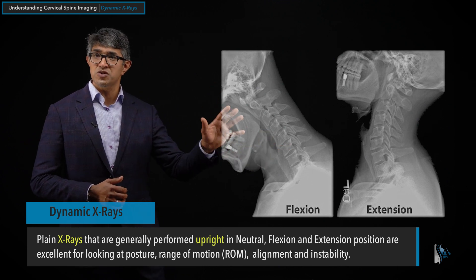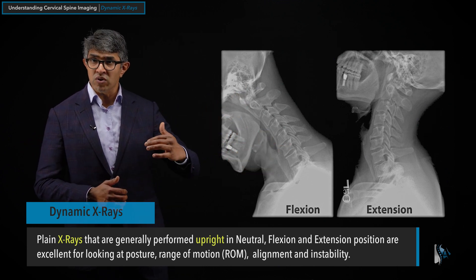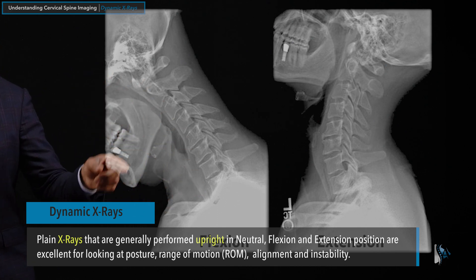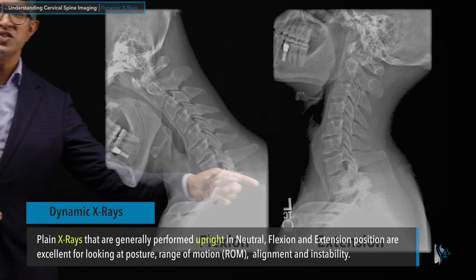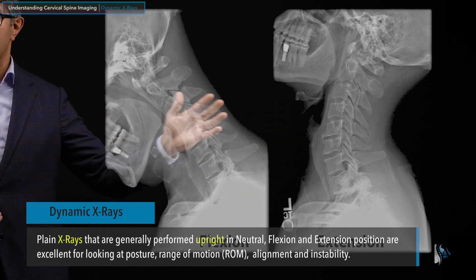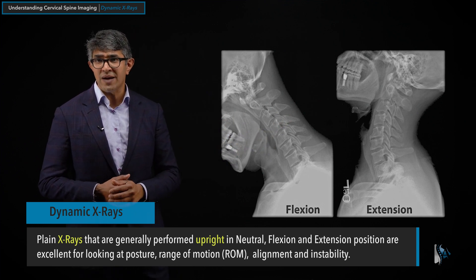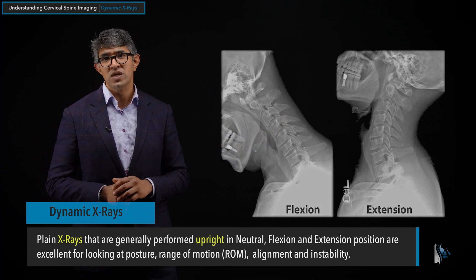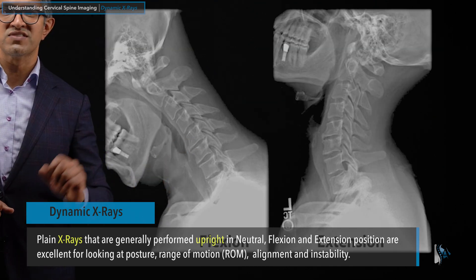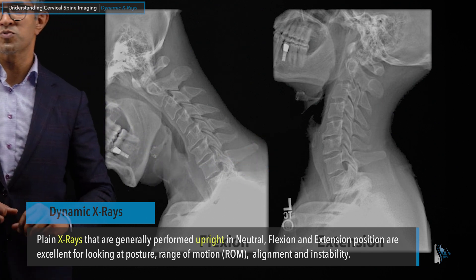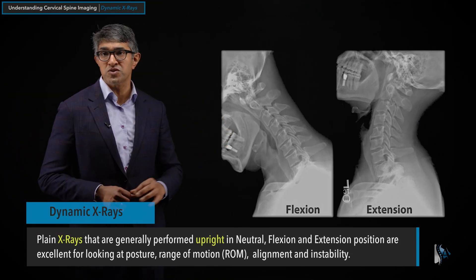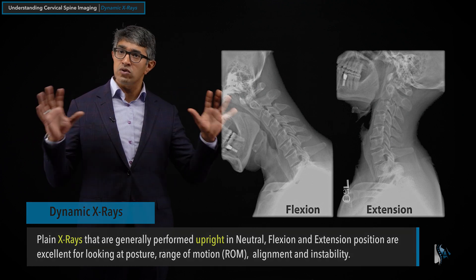In this picture, for example, you can see this person standing up, leaning all the way forward. You can see what the alignment of the cervical spine looks like, even the jaw and the relation of all these different structures. And you can see what it looks like leaning back — giving you a sense of their range of motion, which is not something you can capture with static imaging. You can also see a little bit of the discs themselves — the disc at C5-6 is a little more worn out, some bone spurs there. It's a bit crude — not as good as a CAT scan for bone spurs — but very good for looking at global alignment.